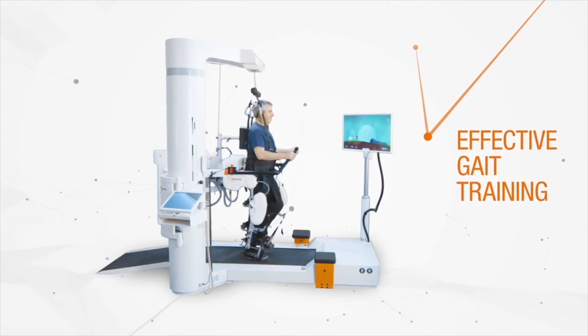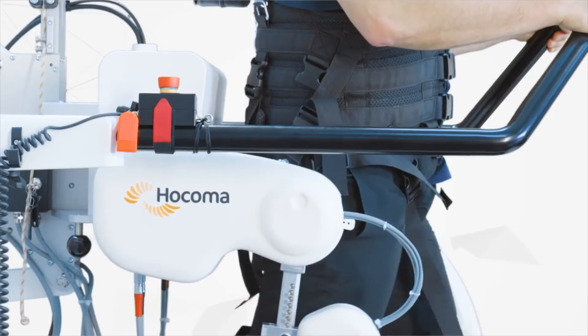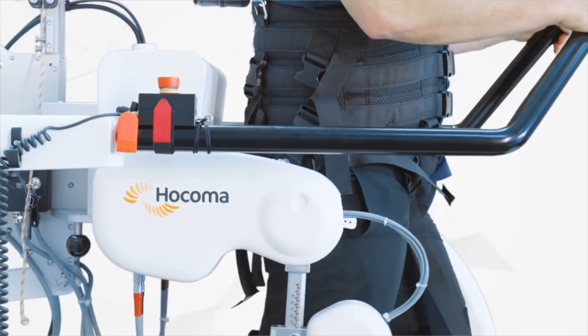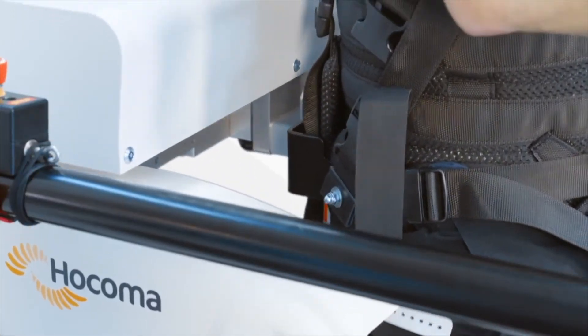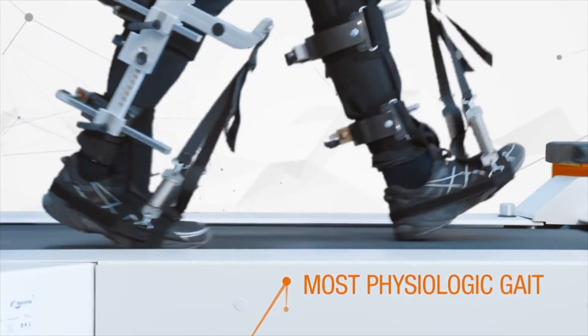Locomad is a commercial lower extremity exoskeleton robot that is widely used in clinical practice. It simulates physiological gait trajectory and can drive the patient's unilateral or bilateral limbs. The speed of the treadmill can be controlled to match the patient's gait.